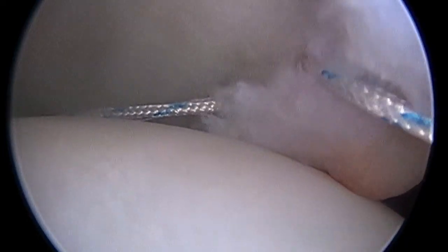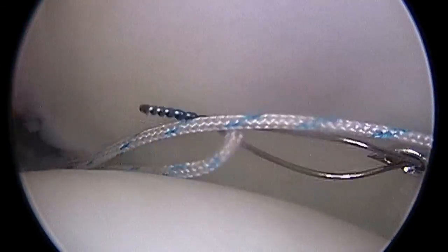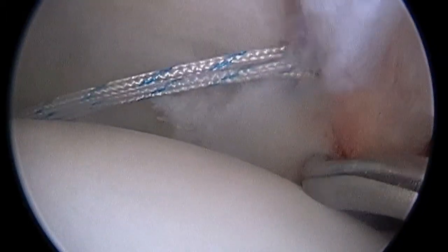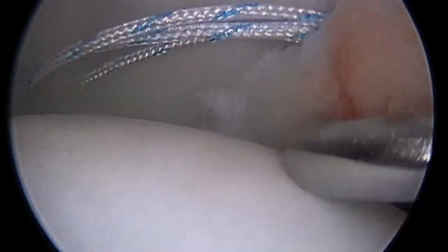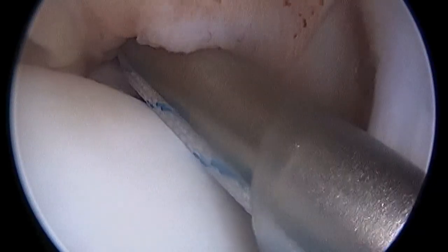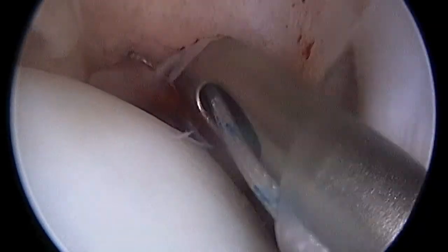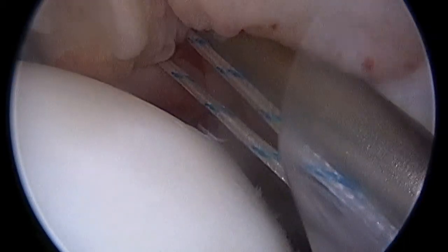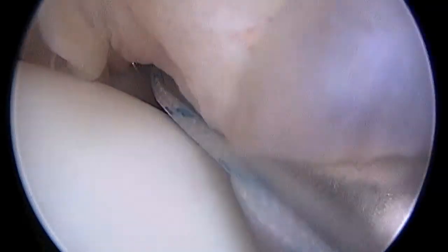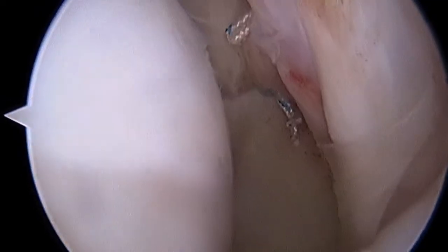Here we are passing the sutures from the second anchor as we work our way up. I'm placing it through the tissue in a horizontal mattress fashion, where both arms of the suture go through the tissue. And then we'll tie that down just like we did the first stitch with the sliding knot. Then you'll see the suture cutting device coming into place.